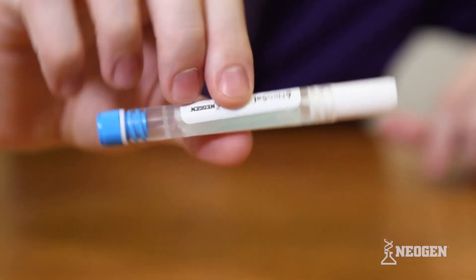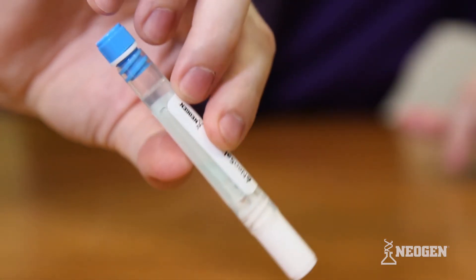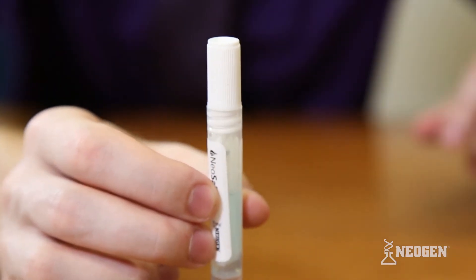The NeoSal buffer tube contains a proprietary buffer which is intended to recover drug analytes from the collection pad and ensures stability of the oral fluid sample during transportation and storage at the laboratory.